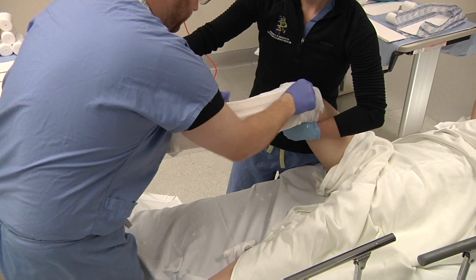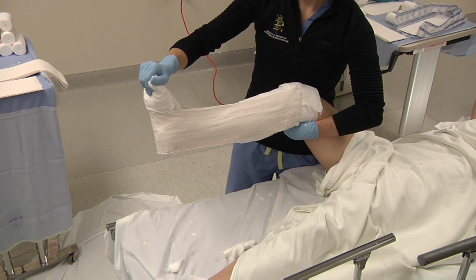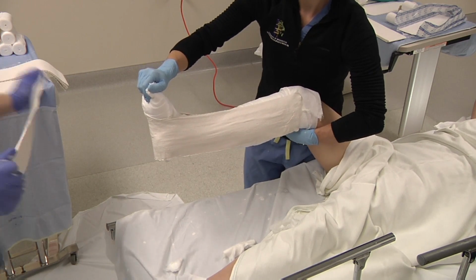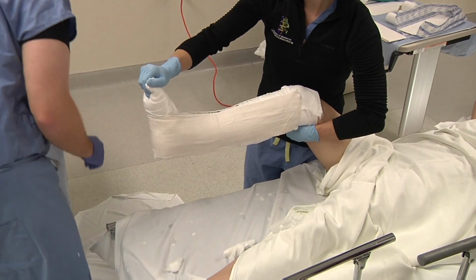Generally leave these a little bit looser, and they extend up a little bit higher than if we were doing just a short leg. And these are, I mean, wetter, so they don't dry as quickly. So we're going to need to laminate our long leg extensions into our short leg. Laminate down here.